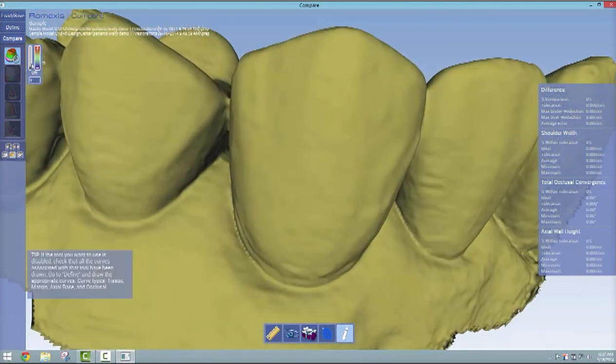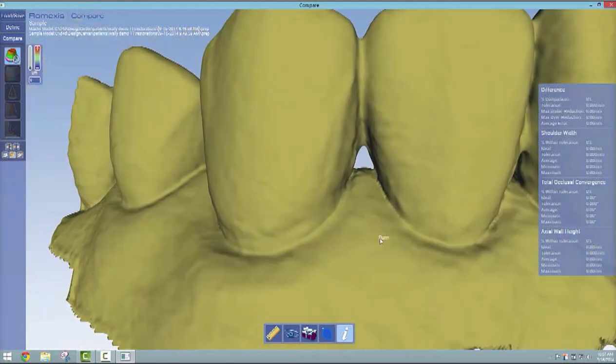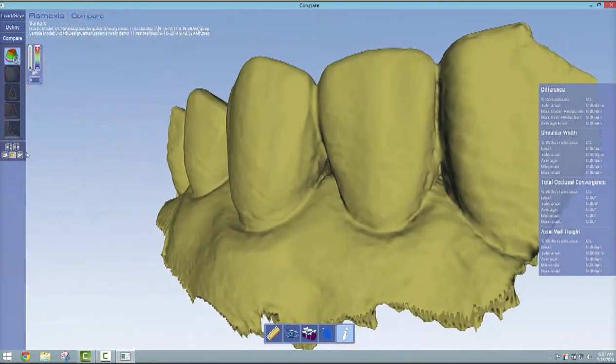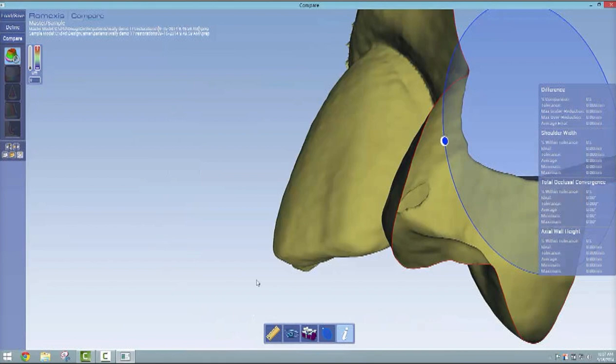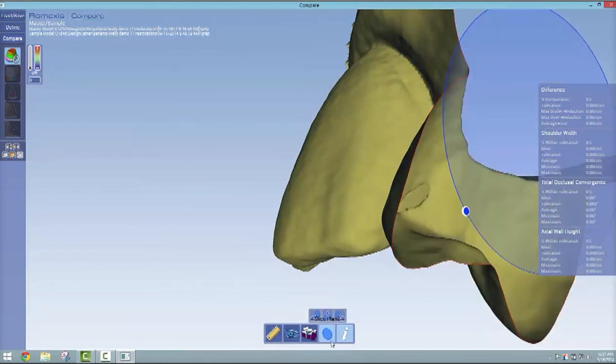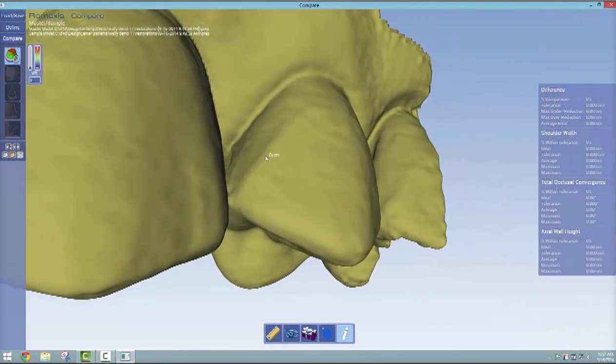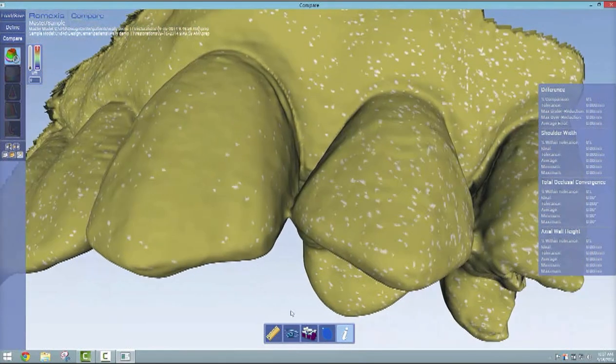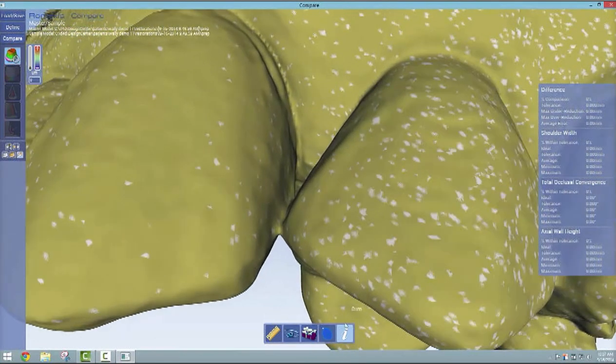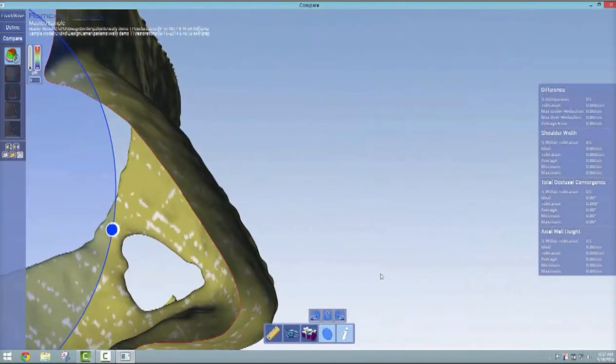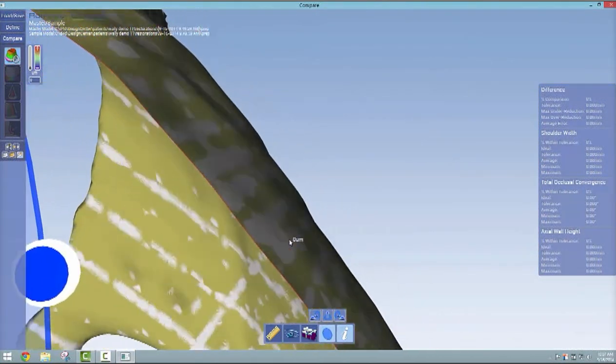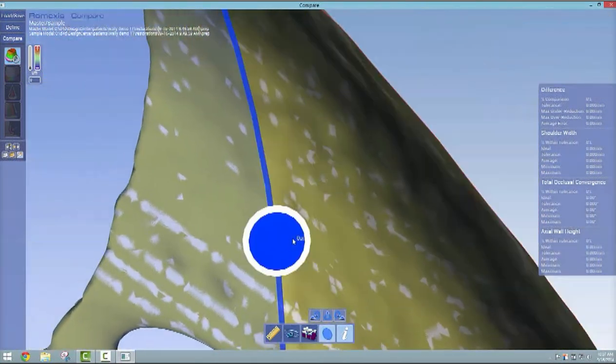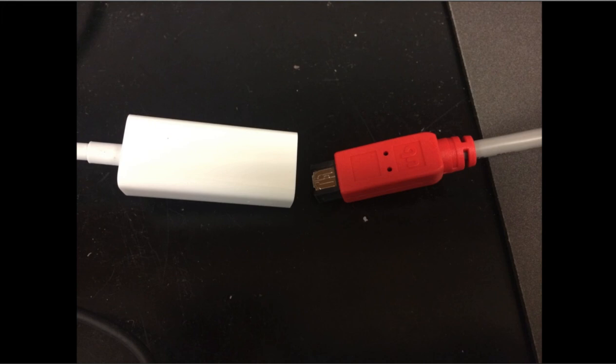No matter where I scroll my mouse, I'm getting zero microns all over, so you can't see any color difference. Likewise, if you go ahead and slice that by superimposing on the master or the two different models, you won't get any differences anywhere. That's good to know that it does align very accurately.